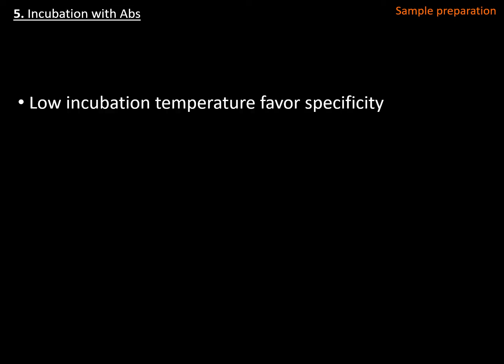In general, while you do the incubation with your antibodies, low incubation temperatures tend to favor specificity because they create more stringent conditions that favor the antibodies binding specifically to your target and having fewer non-specific interactions with the other proteins in your tissue or sample.